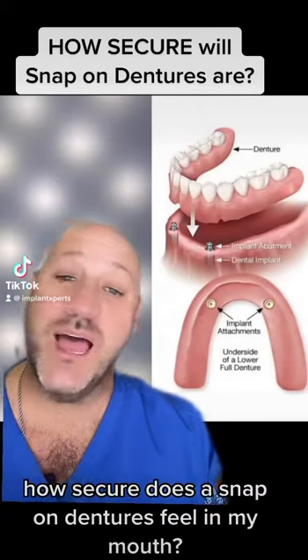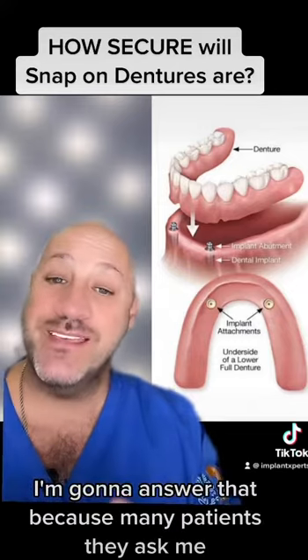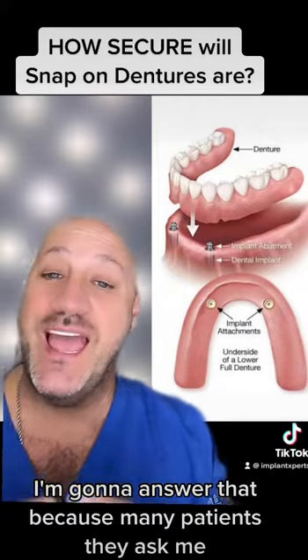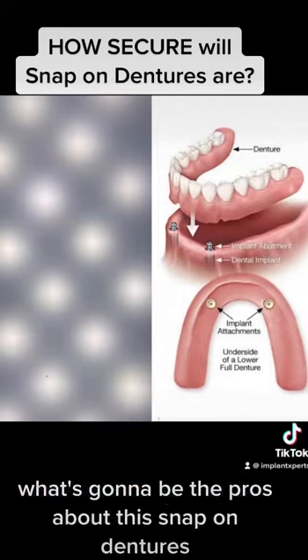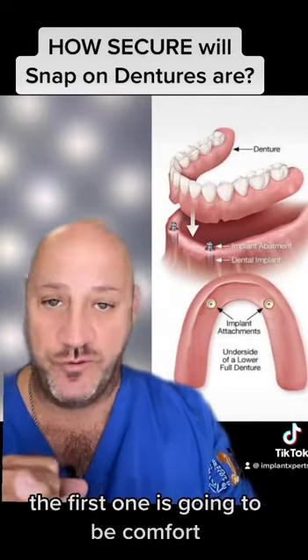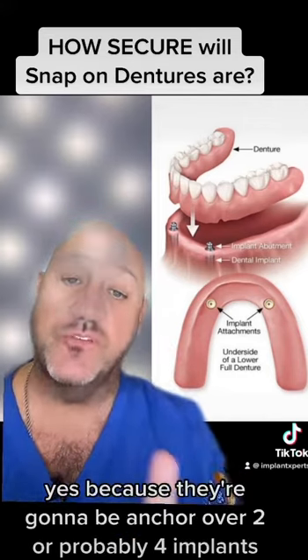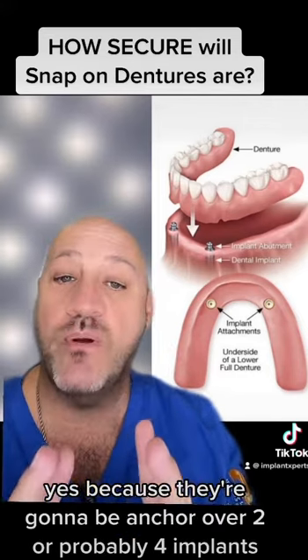How secure does a snap-on denture feel in my mouth? Many patients ask me what are the pros of snap-on dentures. The first one is comfort — you're going to feel more comfortable than with regular dentures, because they're going to be anchored over two or probably four implants.